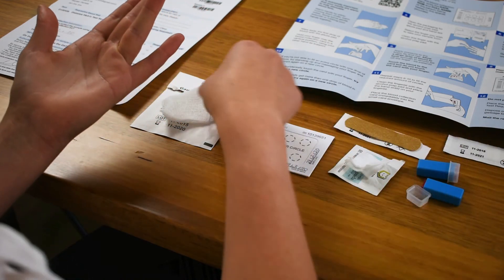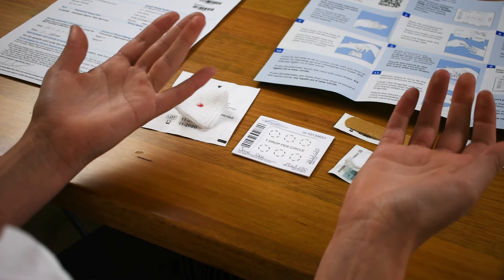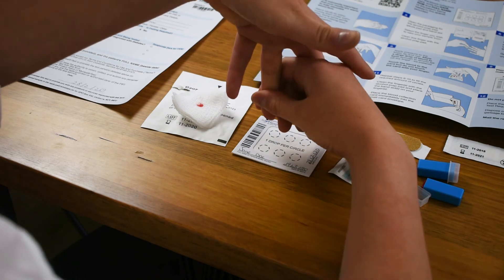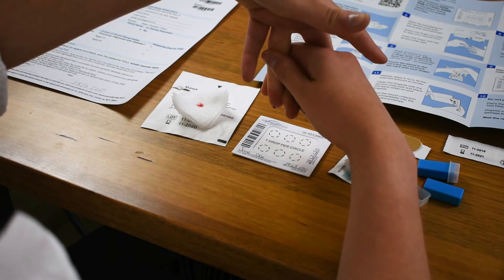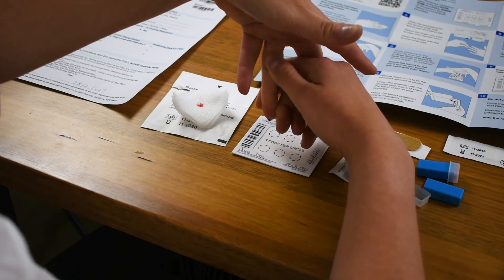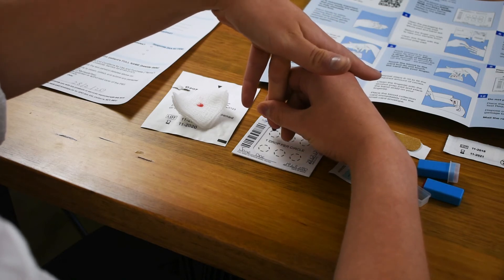Step eight: pick up your gauze pad and wipe away that first drop of blood. Now turn your hand into a vertical position, using your other hand to support your finger, and begin to massage down the finger until you can see the blood starting to form on the end. Keep doing this until you can almost see a blood drop that is about to fall off the finger. Sometimes you need to be quite patient. Once it looks ready to fall off, touch the blood to the card — but not your finger.